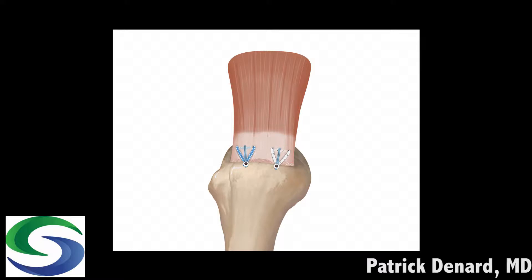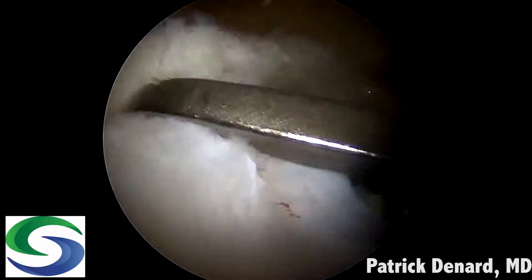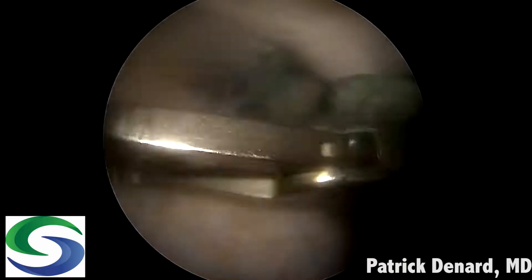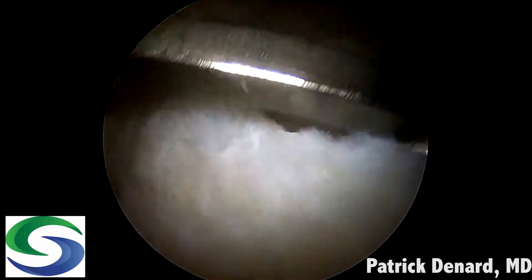You can see there's the same number of passes as a single row triple loaded repair, but it has the benefits of a ripstop. This is a right shoulder viewed from a posterior viewing portal. We have a limited tendon stump due to tendon loss, which is often the case in massive rotator cuff tears.